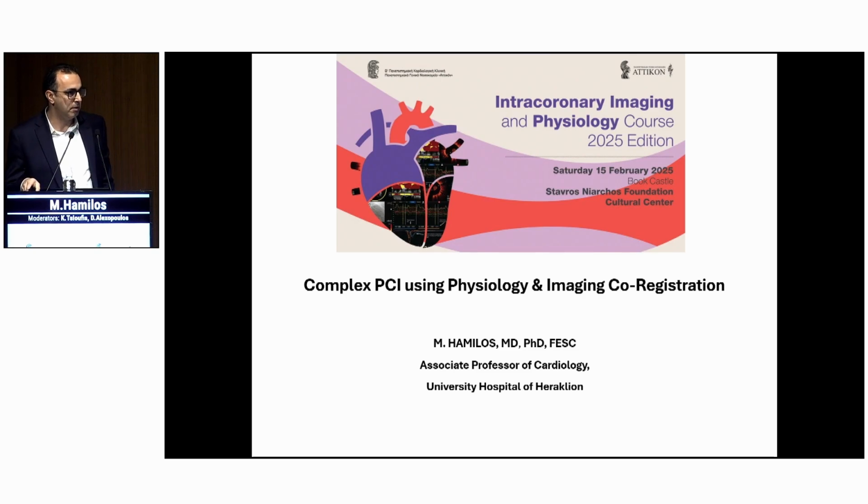I like physiology. I'm a little bit biased with that. Of course, imaging is of paramount importance in this case, but I thought that I should estimate left main with physiology and LAD together. To do that, it's crucial to open first the right coronary artery, to have the area that is real for the left main, because otherwise you have also the right coronary artery area and you don't get the good results.